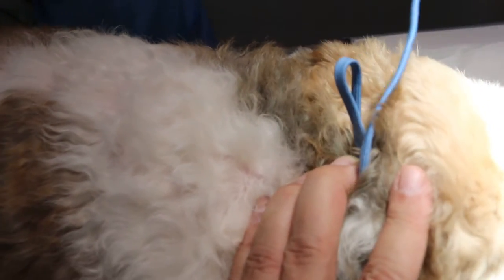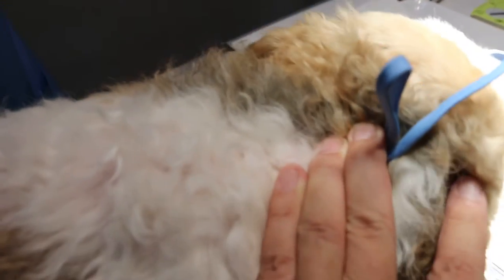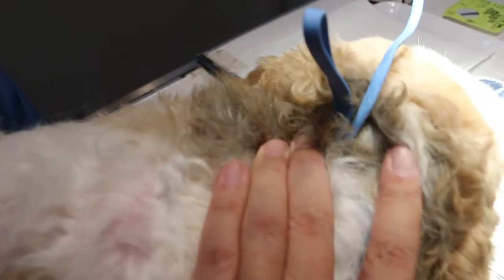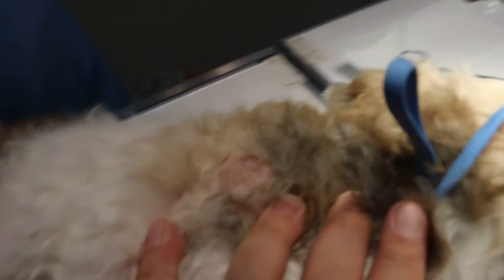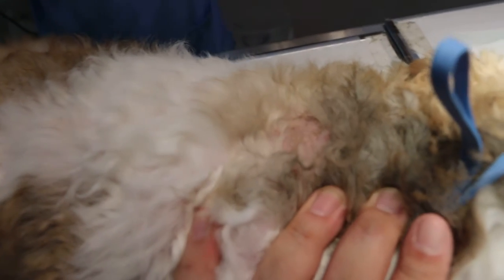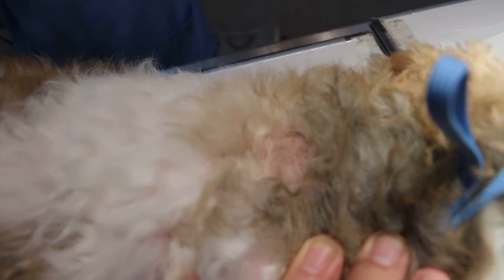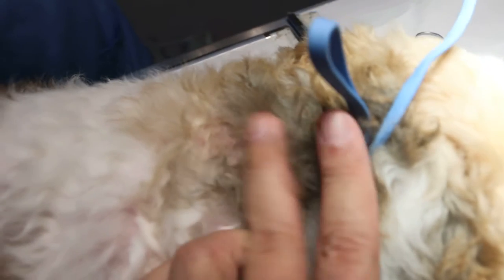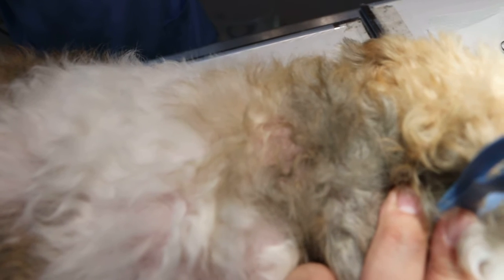This is an 11-year-old male neutered Shih Tzu coming in with a complaint of skin disease one month after going to the groomer for shaving. The owner discovered ringworm-like lesions on the body and they are quite big rings. Under ultraviolet light there is fluorescence, and under microscopic examination you can see the hyphae. So these are ready to be identified as dermatophytes, or ringworm.